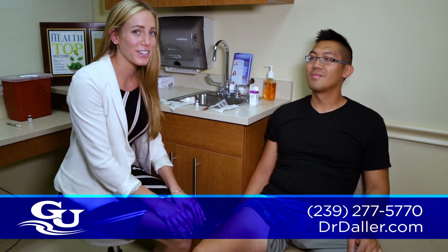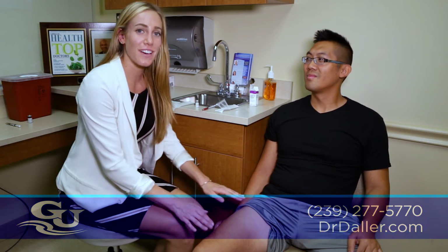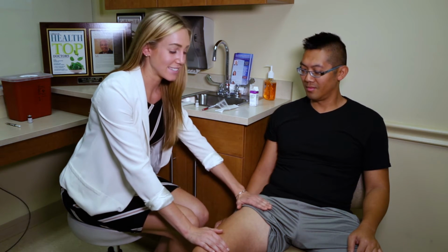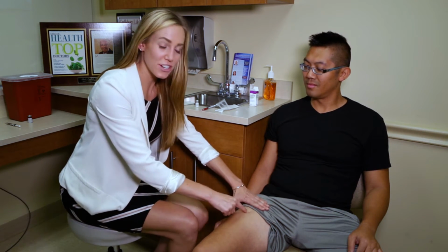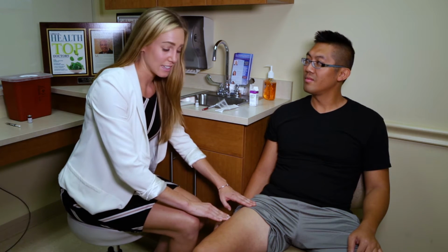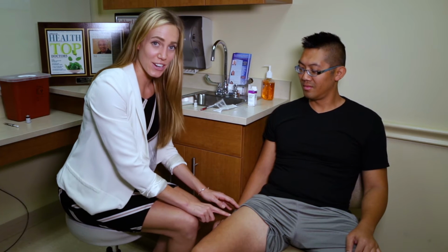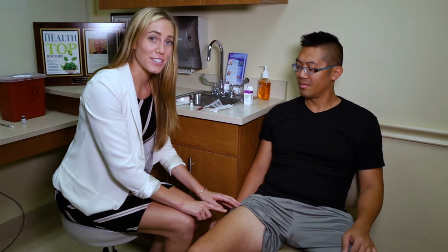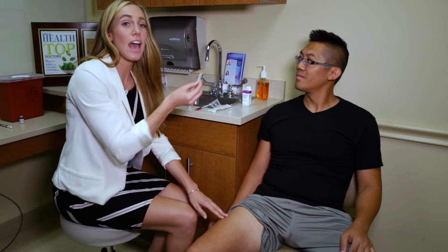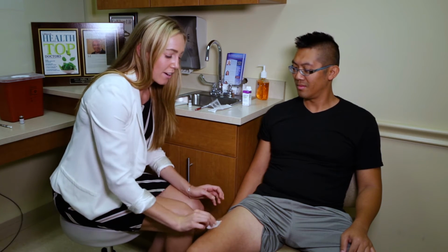Now you want to prepare your injection site. First, you want to divide your leg by thirds using your hands. So you place your hand here and here. Next, draw an imaginary midline down the center of your thigh, and you want to go lateral to this line. This right here is your vastus lateralis muscle. This is what we consider the safe zone. So you want to find this area and use an alcohol prep pad to clean the area.